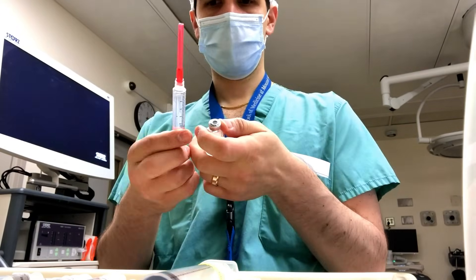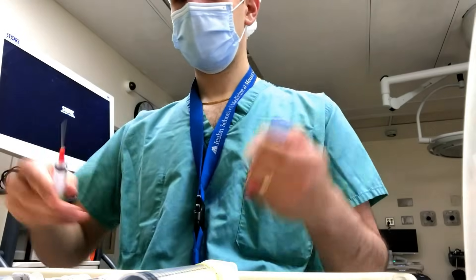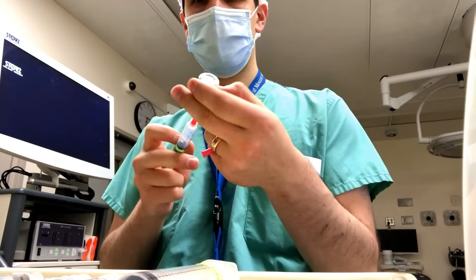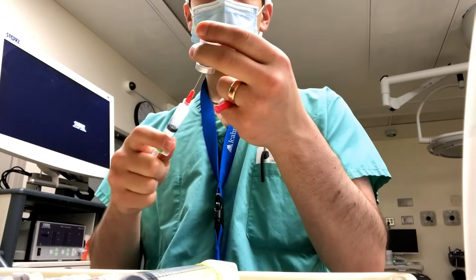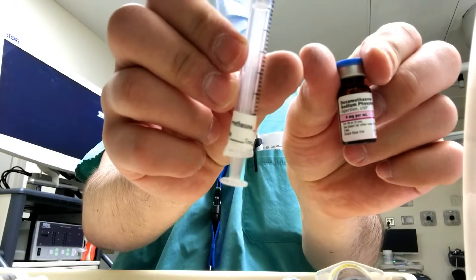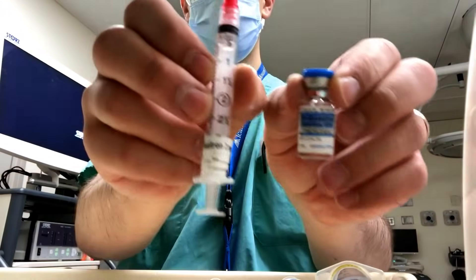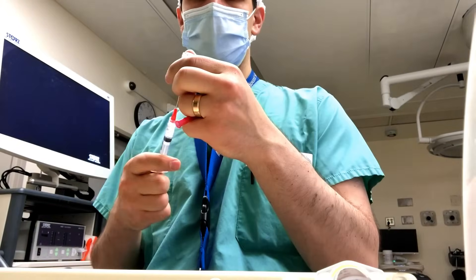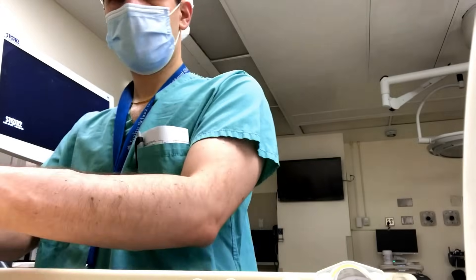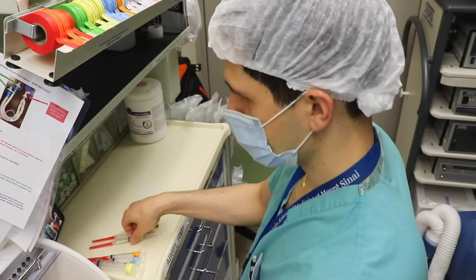Here's my rocuronium, and here's my glycopyrrolate. If you're interested in learning more details about the medications stocked in this cart, you can check out a video narrated by Dr. Erica Fagelman, one of the former chief residents and current liver transplant anesthesia fellows at Mount Sinai Hospital. Next up is neostigmine, dexamethasone, ondansetron or Zofran, and two percent lidocaine — I'm drawing up five milliliters of it. I'll put all my drugs in a lockbox; some controlled substances I'll need to draw up later once the pharmacy opens.